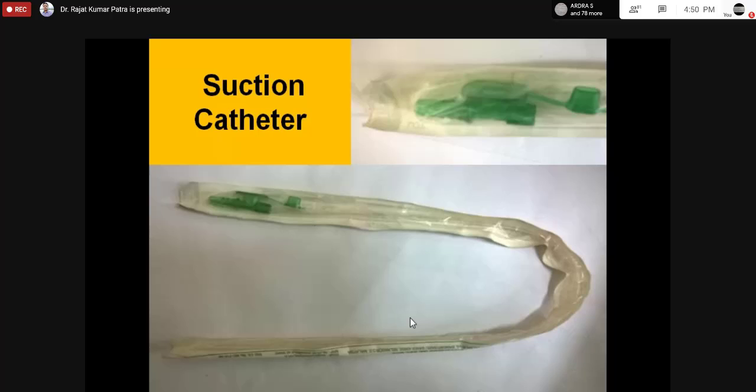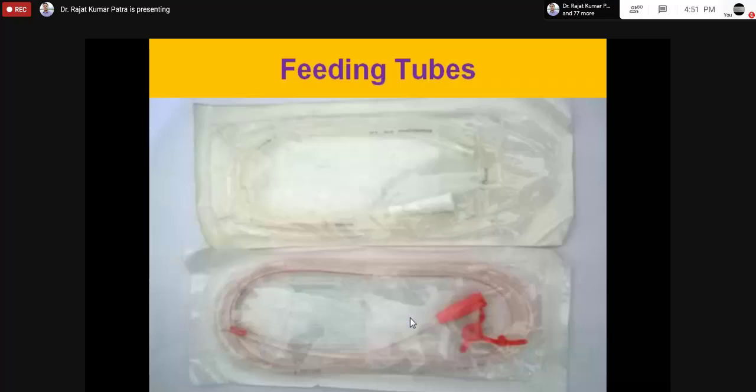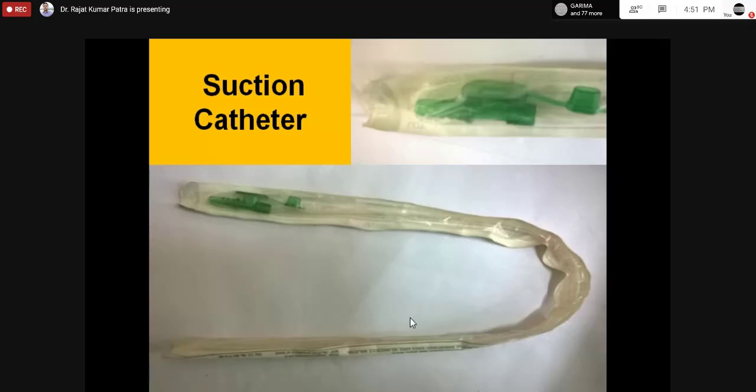What is this one? This is a suction catheter. What is the use of a suction catheter? Anybody? Suction catheter is mostly used in anesthesia cases, okay, during anesthesia or during extubation, and mainly in the ICU setup, for oral suction. This catheter is used in emergencies. These are small sizes, and these are large sizes. In comparison, feeding tube and Ryle's tube, you can tell the difference from the size only. This is the Ryle's tube size, this is the suction catheter. So by seeing only you can say it.